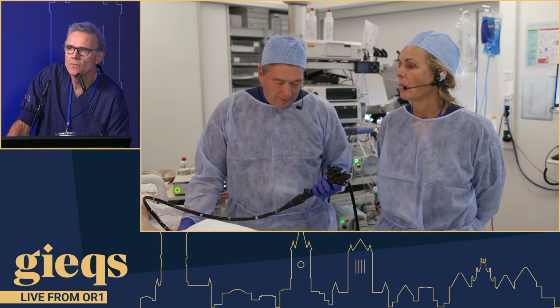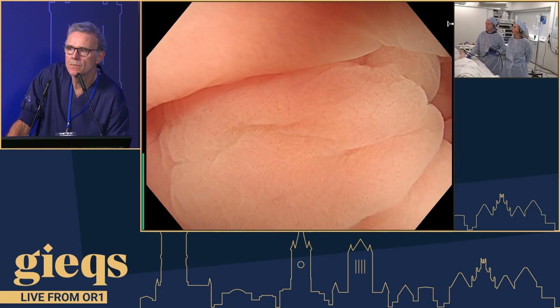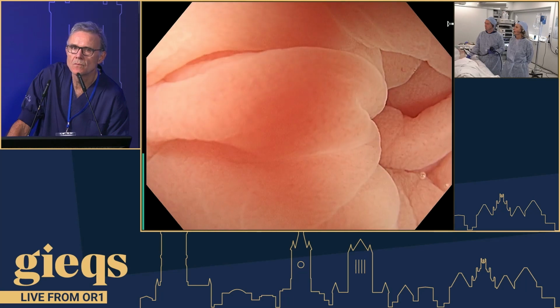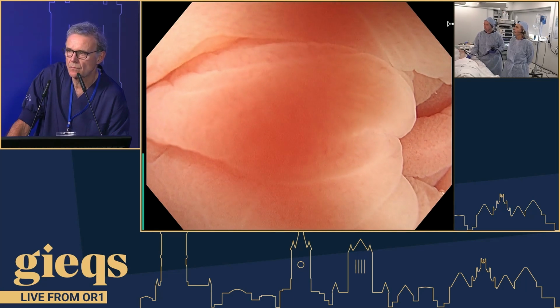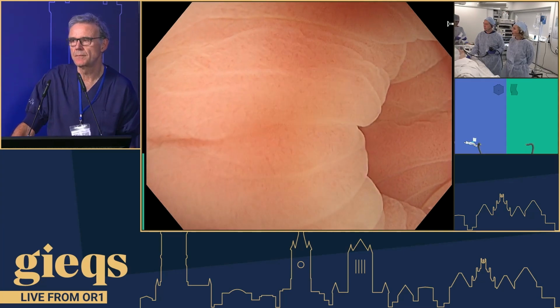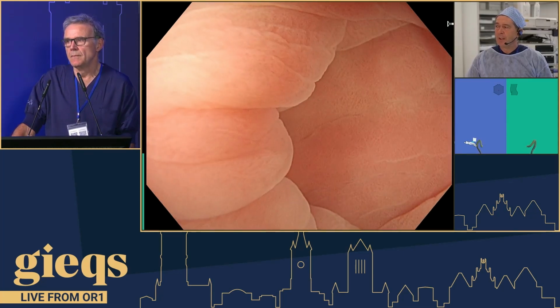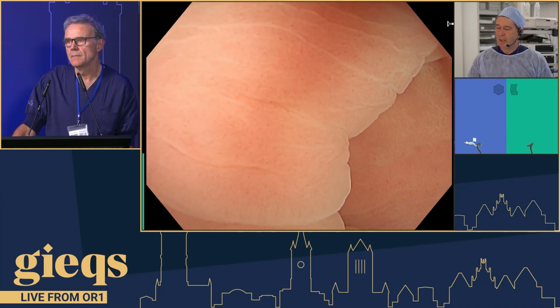Obviously, I've done all the things that we talked about before. So we're underwater. We've got the near focus on. We're just going incredibly slowly here. We're just allowing the tip to find a way. The foot is not on the water pump all the time. We just add a little bit of water, open it up, just wait. And then if necessary, we can put some gentle pressure to get around the next fold.